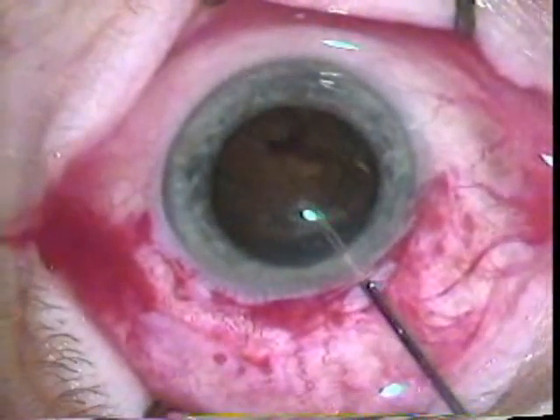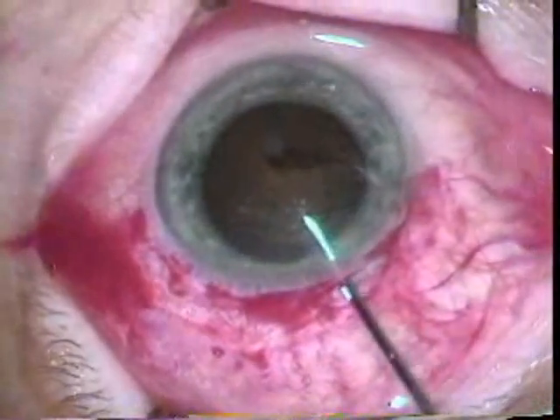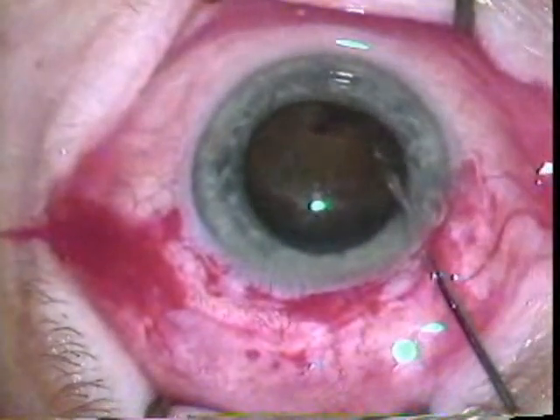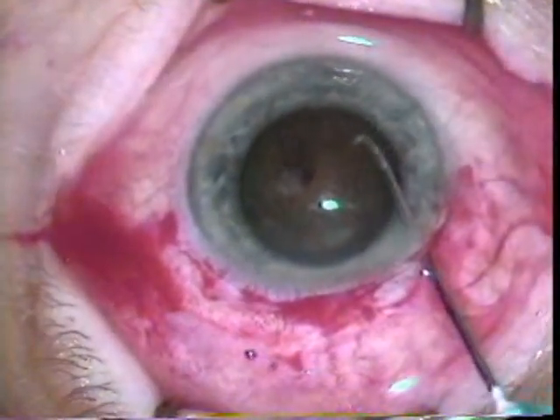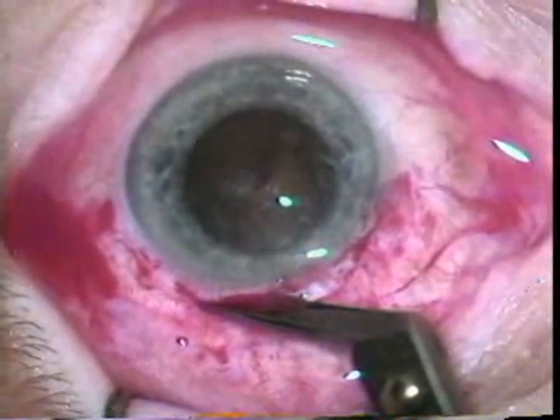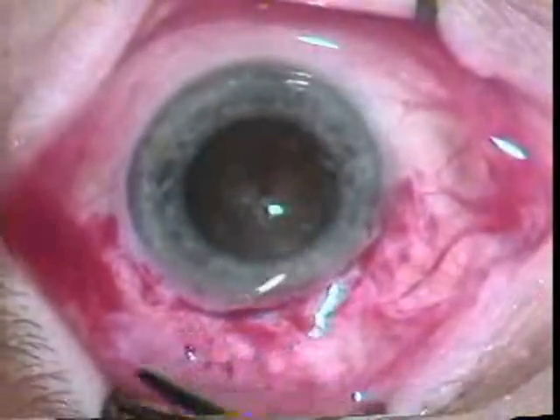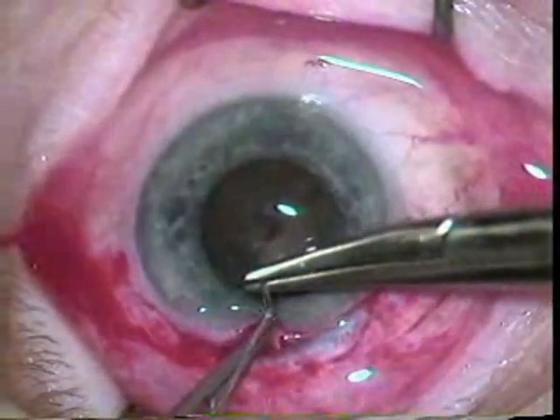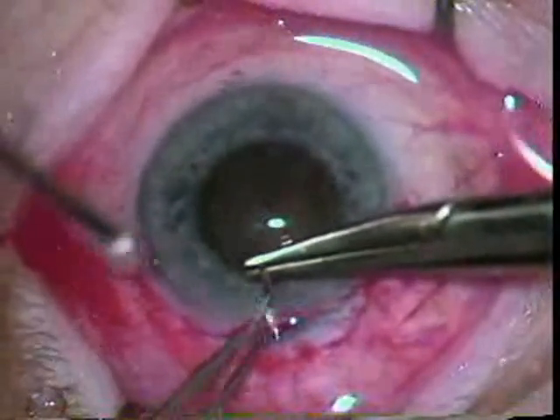This small section that was opened up for the rocking of the lens and for the capsulotomy is extended using Castroviejo scissors, which are used going in one direction.